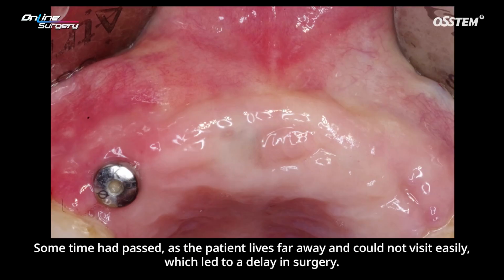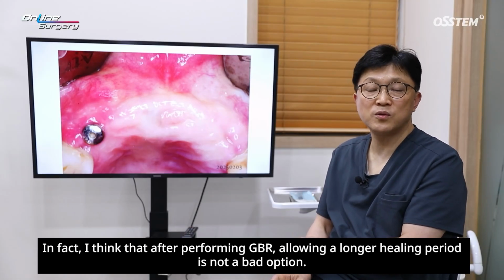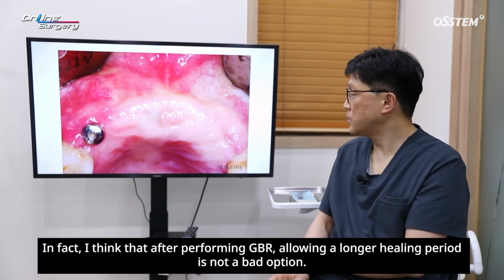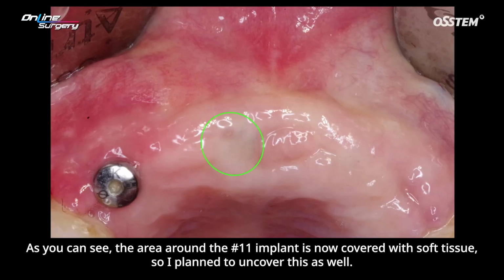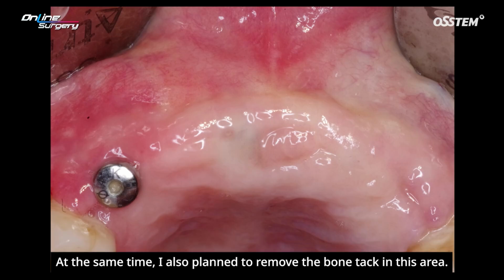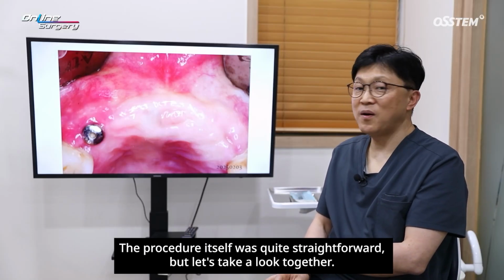Some time had passed, as the patient lives far away and could not visit easily, which led to a delay in surgery. In fact, I think that after performing GBR, allowing a longer healing period is not a bad option. As you can see, the area around the number 11 implant is now covered with soft tissue, so I plan to uncover this as well. At the same time, I also plan to remove the bone tack in this area. The procedure itself was quite straightforward, but let's take a look together.